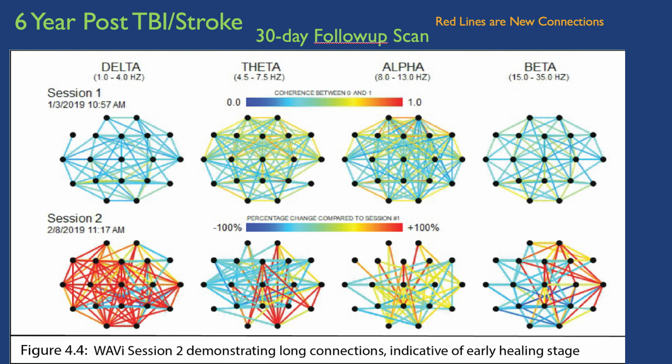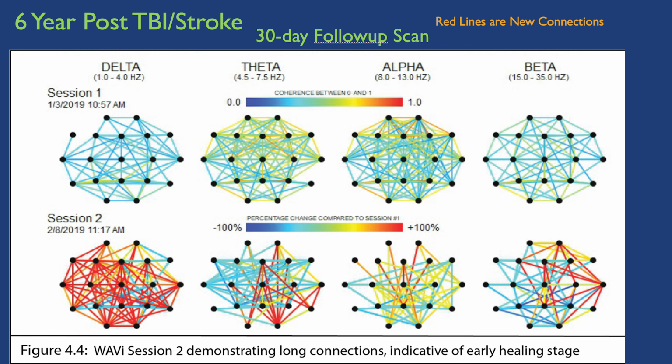Now, you wouldn't see this on an MRI. There's no way the MRI is gonna show you these connections, but you can actually see where the coup and the contre-coup is. See, there's a contre-coup, and again, pretty devoid of stuff, both on all of these, but on the right side of the brain, you get continued repair work done.